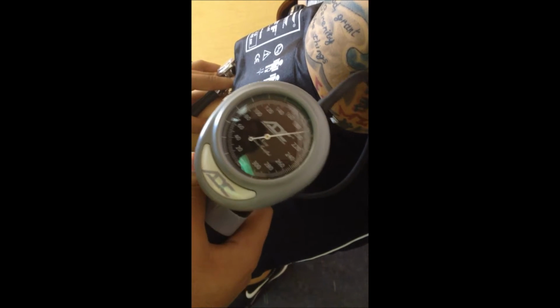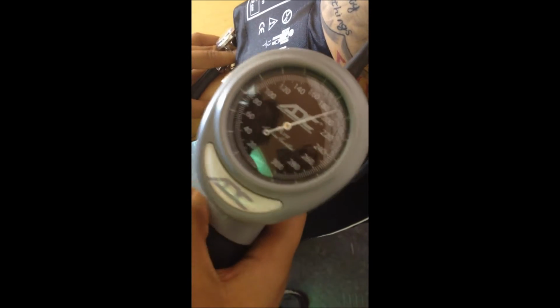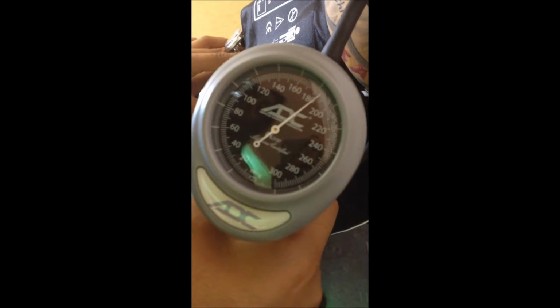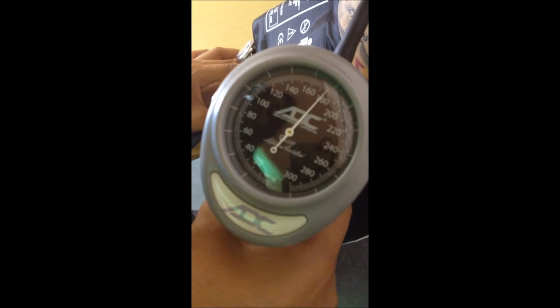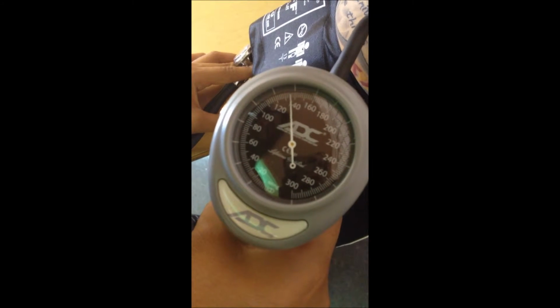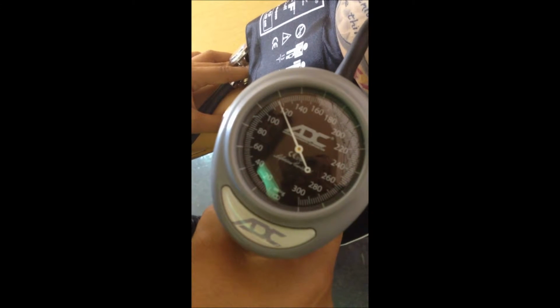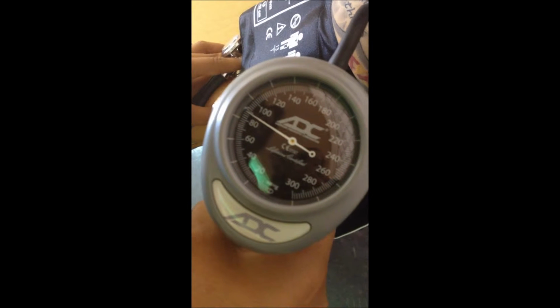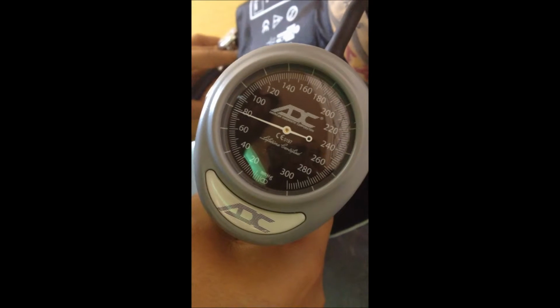Then slowly release the air at about 2 to 5 millimeters of mercury per second. Pay close attention to the first sound, because that's going to be your systolic pressure. And the last sound that you hear, that will be your diastolic pressure.